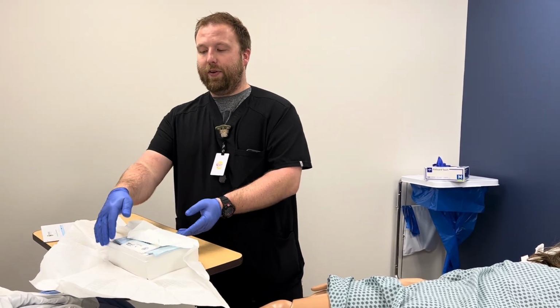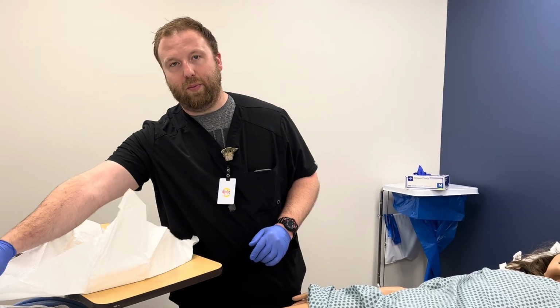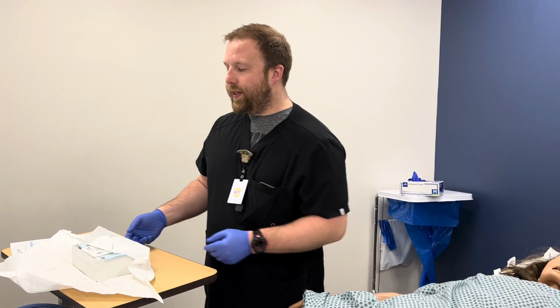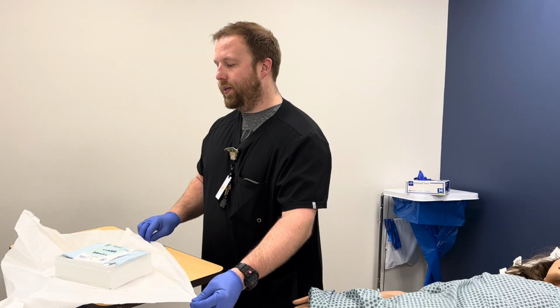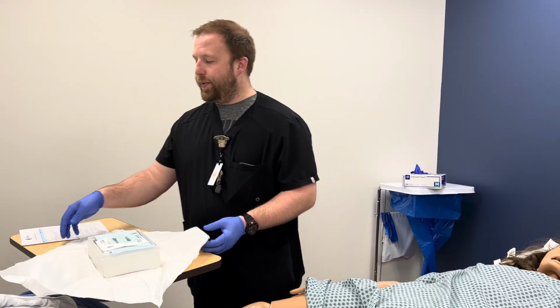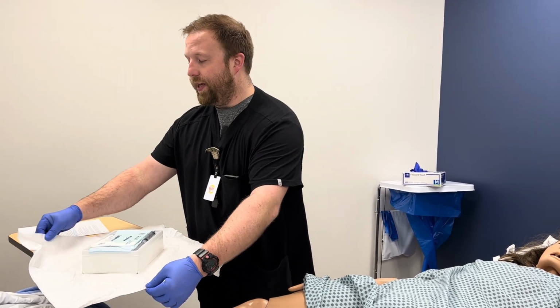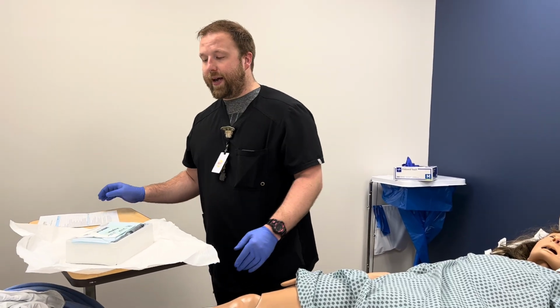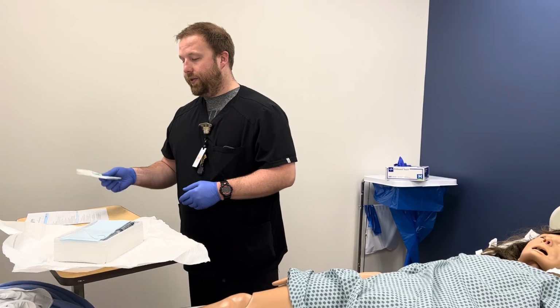If you open it backwards, we have to pay attention to here, I'm reaching over my sterile field. Just make sure when we open kits like this, the last pull is towards us, and we don't want all this to happen. And remembering we have an inch on the outside of this that we can touch and move this kit around with. I definitely don't want to turn my back on this kit. I don't want to reach over it. I don't want to do any of that.